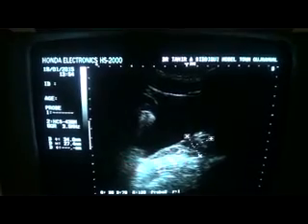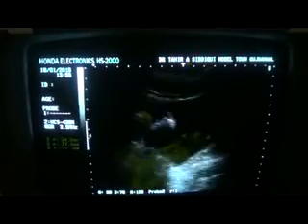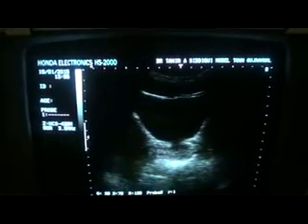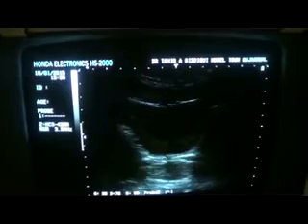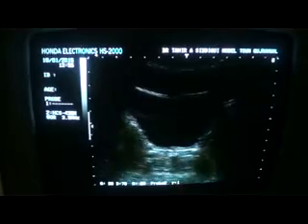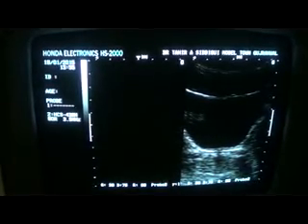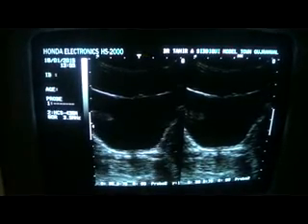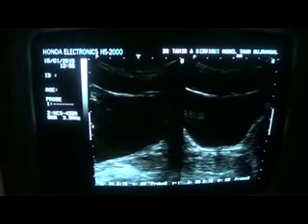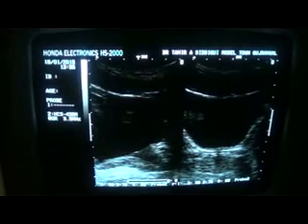Please do not include this tail area in your measurement. This is the longitudinal section of the prostate. Place it on the right or left side of the image, wherever you like.